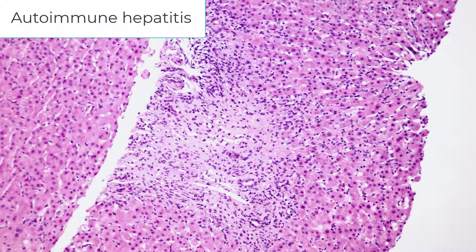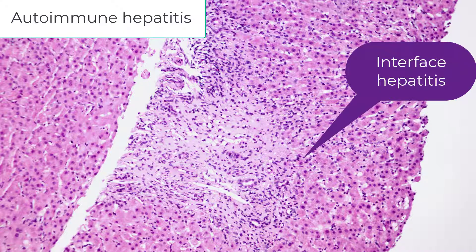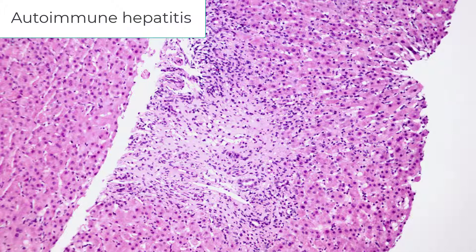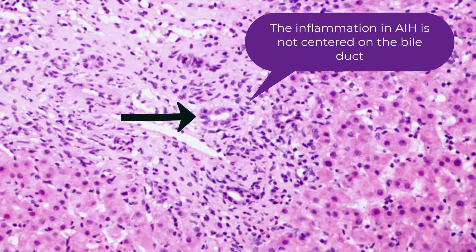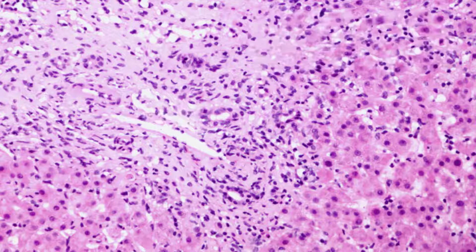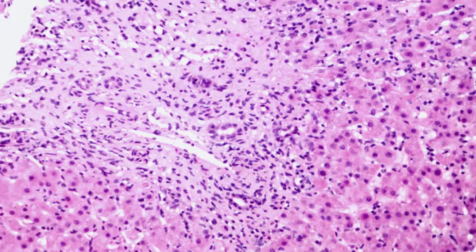This is autoimmune hepatitis. There's interface hepatitis here. You can see plasma cells in PBC, and you can also see interface hepatitis in PBC. The difference lies in the bile duct — notice that bile duct looks a little disheveled, but the inflammation is not centered around the bile duct. If you look at PBC, you will notice that the inflammation is centered largely around the bile duct.